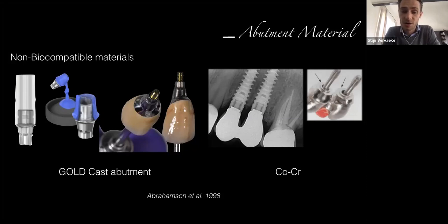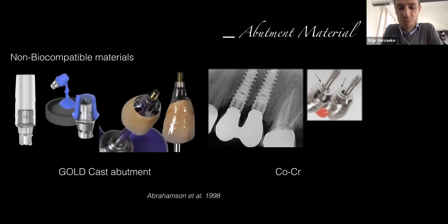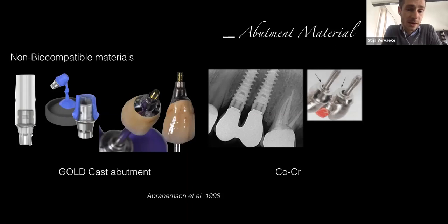It's not that long ago that someone was telling me about an EV implant, a 4.8 millimeter implant, which is basically an implant that can't break, but it did. It broke. Someone was already blaming the implant, and we looked at the radiographs, and there was just a cobalt chrome abutment made on top of that implant, which was not fitting really well. Then of course you don't get a very nice fit, and you get micro damage first, and then you really fracture afterwards. So implants should not be restored with gold abutments or cobalt chrome abutments.